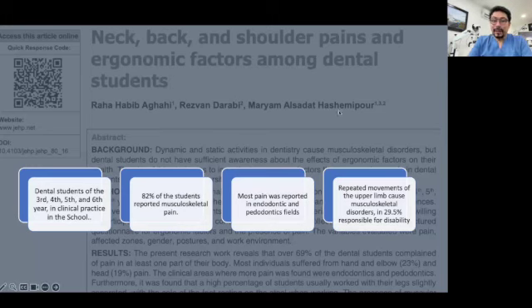And one of the things that we need to have in mind is that these musculoskeletal disorders can generate even a 30% of people getting retired earlier than expected because of disability. So the ergonomics that we are going to obtain because of the microscopes are really advisable to have. The microscope will force you to have a proper position.